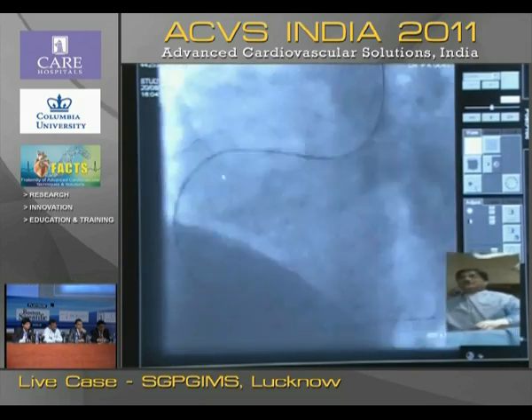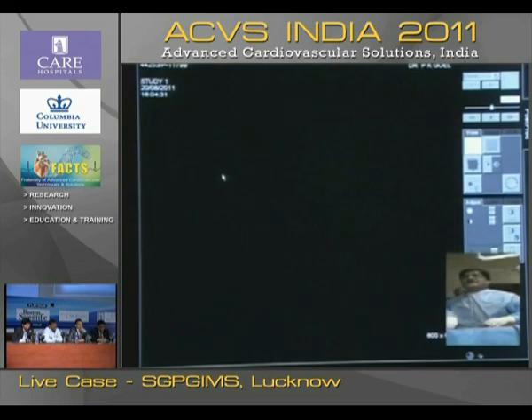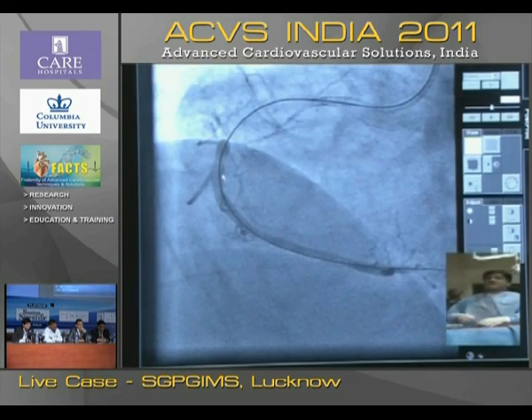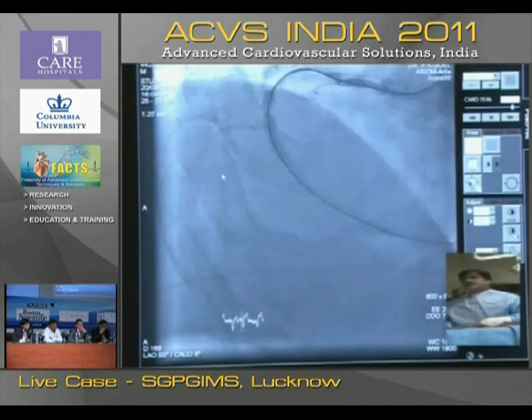Okay, so we have made a channel, so I think that's a good thing. Now give me a whisper wire. Pass. Give me a whisper wire, please. Now you can pass the soft wire and remove this wire.